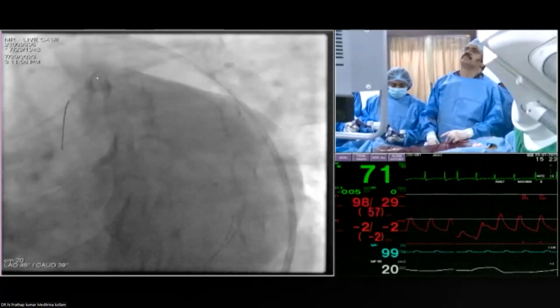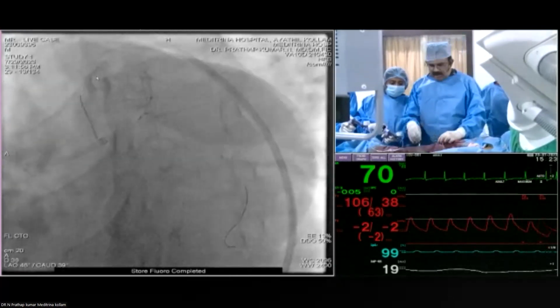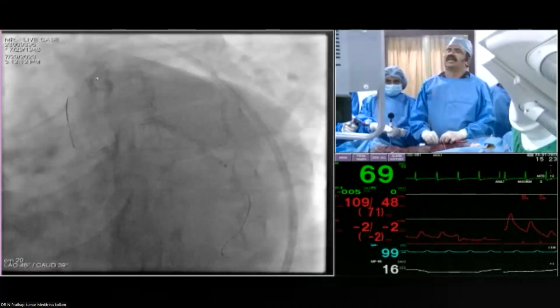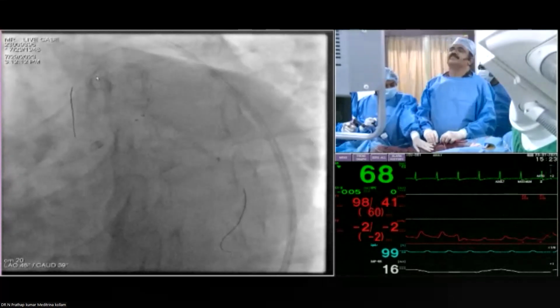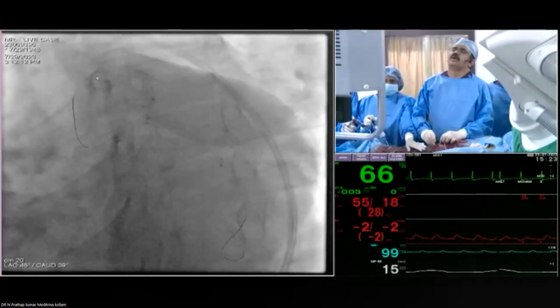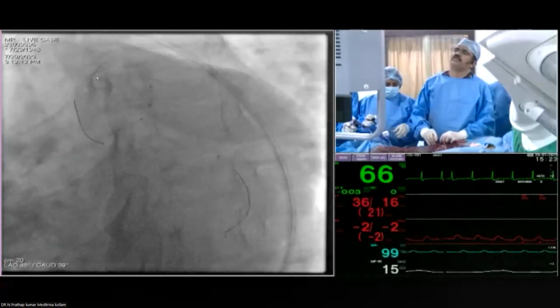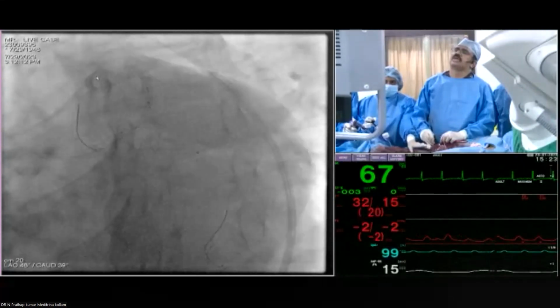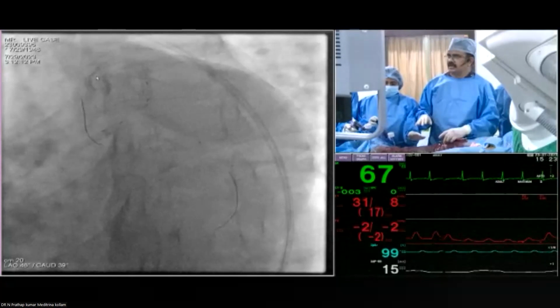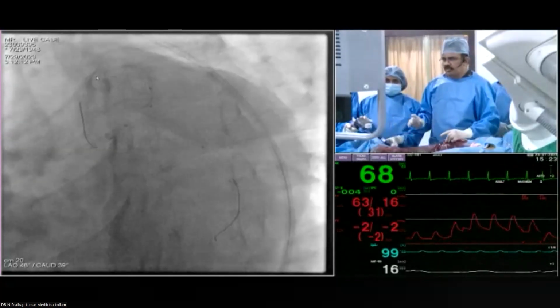To be honest, for me, you should have a bit more protrusion from the stent. I think we will see, definitely we will show this by an OCT and show that my ostium is covered. That is more important. Yes, but your ostium should be covered, with minimum modification of the 3 millimeters. The modification of the ostial DK crush now is taking the same balloon back, going at a high pressure and dilating. That is actually the side branch optimization. Can you go with 15 atmospheres now?